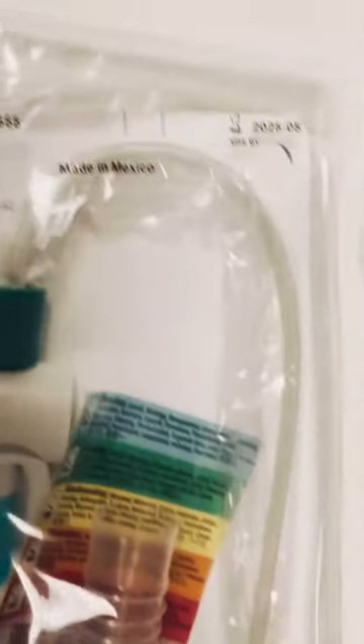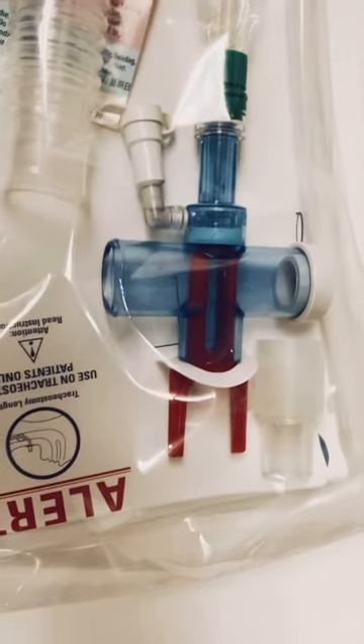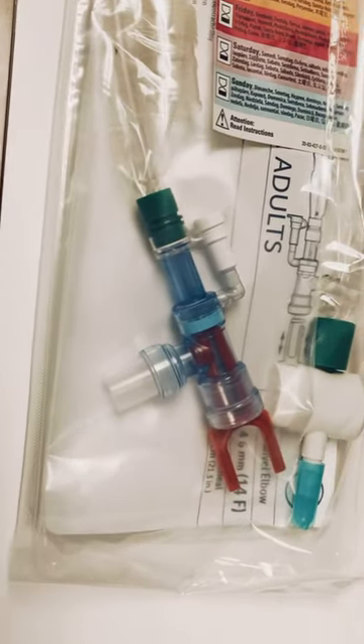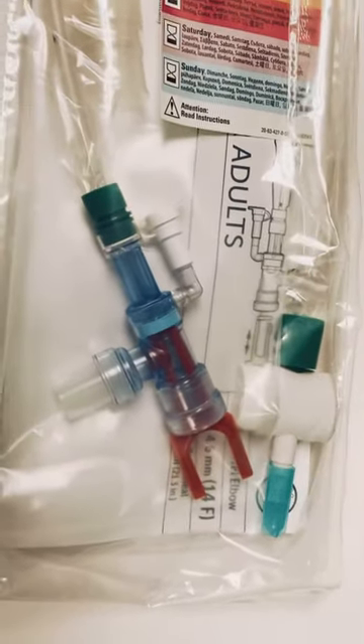So when you pass this catheter through, it goes in this case to the tracheostomy tube, down into the patient's airway to suction secretions out. In this case, the much longer one goes into the endotracheal tube, down into the endotracheal tube, and allows you to suction the patient's secretions out.